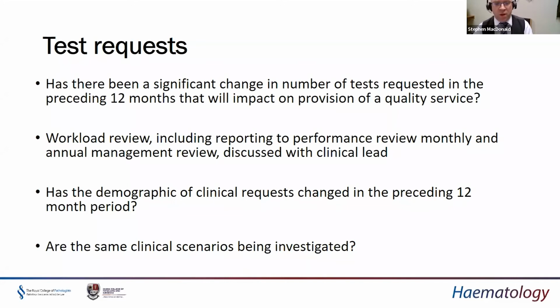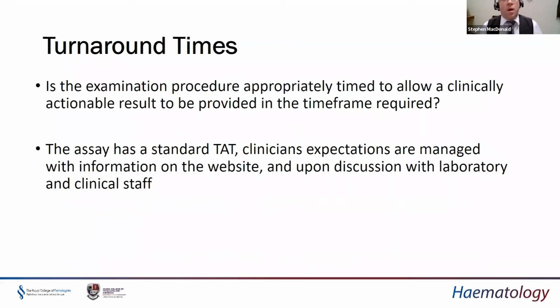We've seen this recently with a number of tests that we provide in the hemostasis lab, where completely different populations of patients are now having a test done, which we never used to test. And accordingly, we need to make sure that our testing strategy fits their needs as well as the established needs.